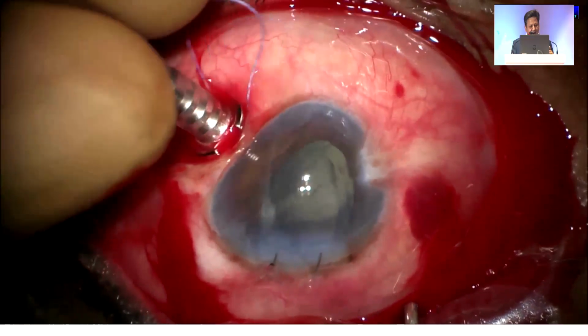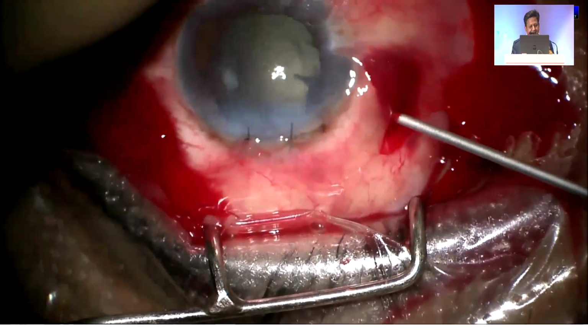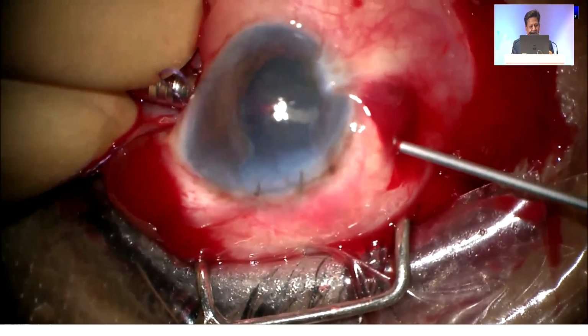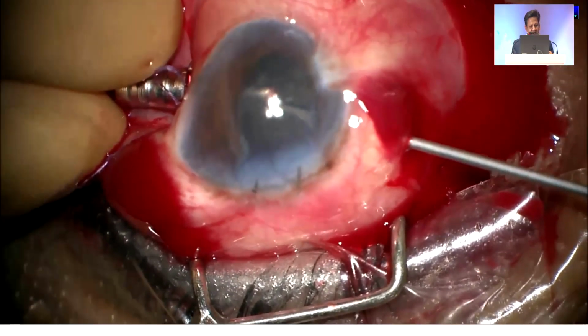There is a lot of hypotony. There's difficulty in insertion of the infusion cannula. And even if you get the insertion, it goes into the suprachoroidal space. You have to make sure that the cannula is now in the vitreous cavity, and only then you start the infusion.